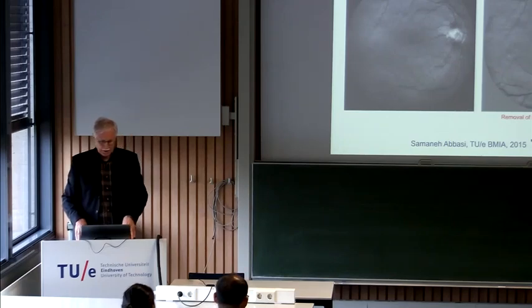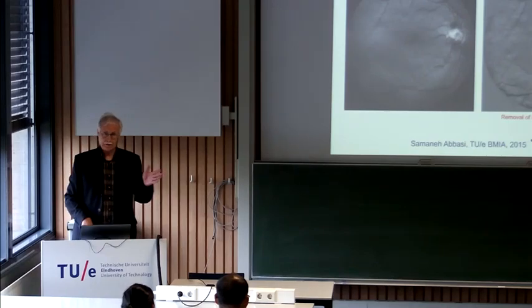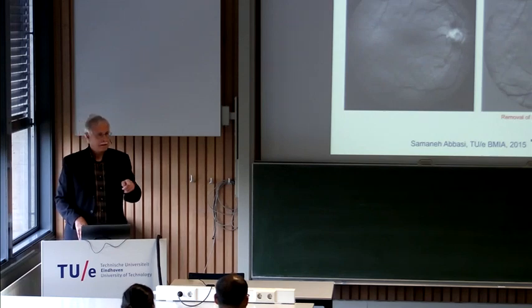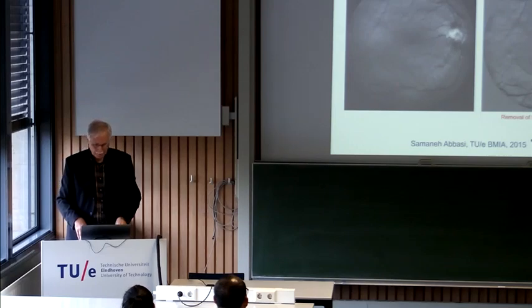The first step was image background normalization. And we know in deep learning, we always do a lot of background normalization. And why in the world is it necessary? Well, for two reasons. You may have inhomogeneous illumination, and you see that that's clear. That may be due to all kinds of reasons. That may be due to the anatomy, due to the camera, or due to the lighting system.